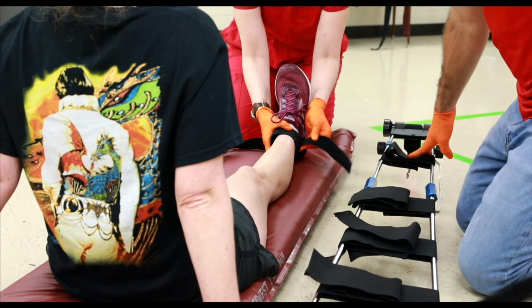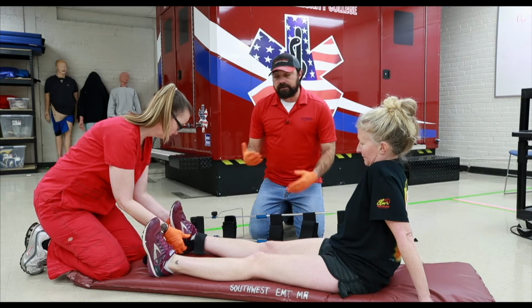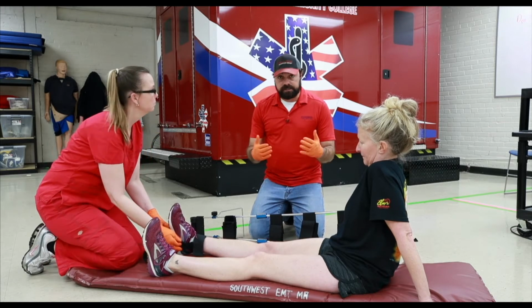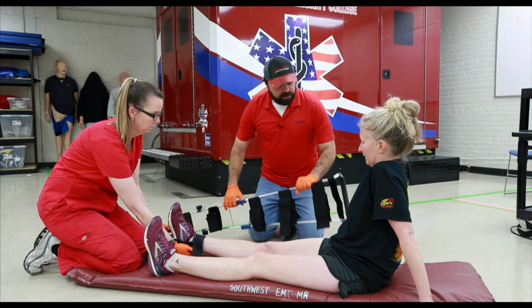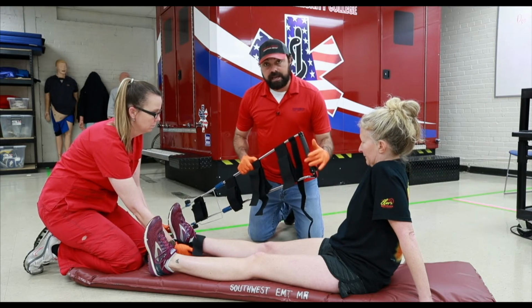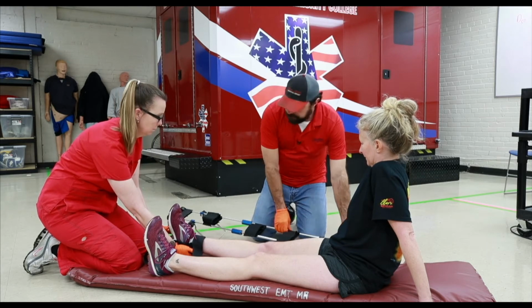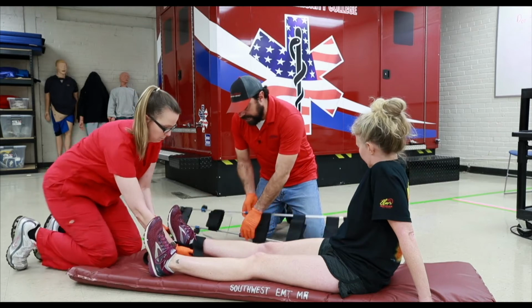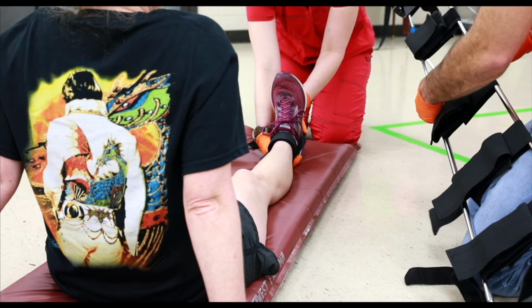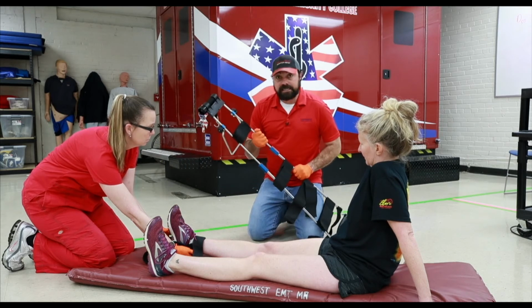You're going to get your device out, and you would want to measure this on the uninjured leg. Now, obviously, we're videotaping, so I'm going to just do it from this angle, but you would want to do this against the uninjured leg. Your goal is you want to try to set this right at the bottom of the buttocks, just where the leg and the buttocks kind of meet. That's your goal. And you want to go about 6 to 8 inches past the leg. So how you do that is you have these little knobs here. You can twist them. It makes this easy to slide.